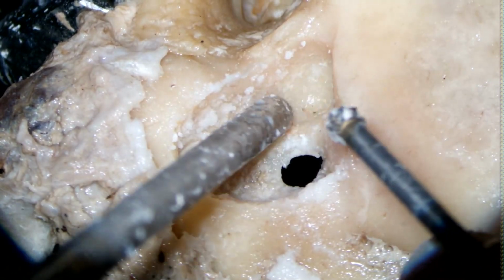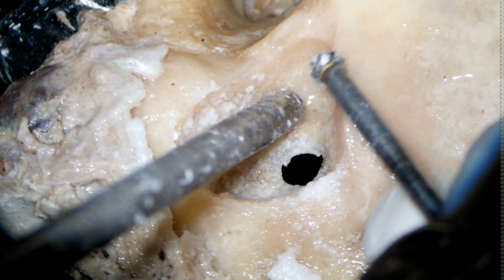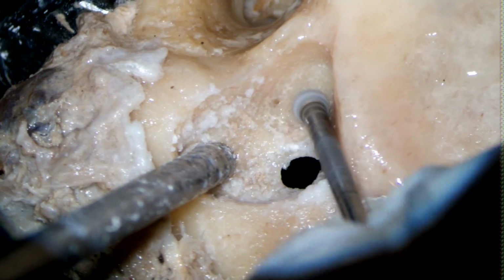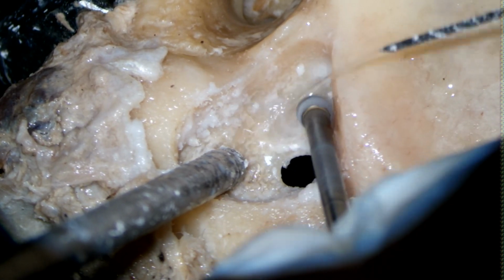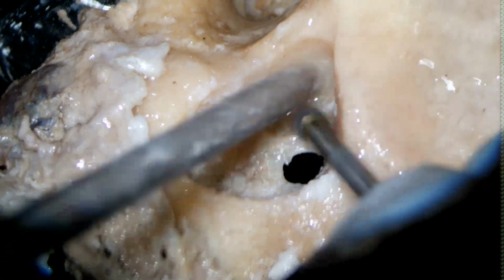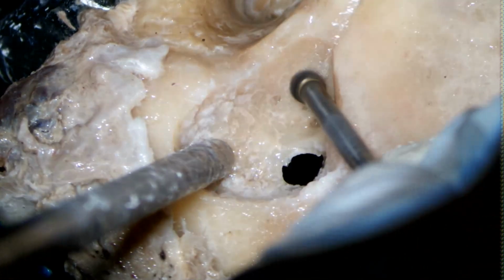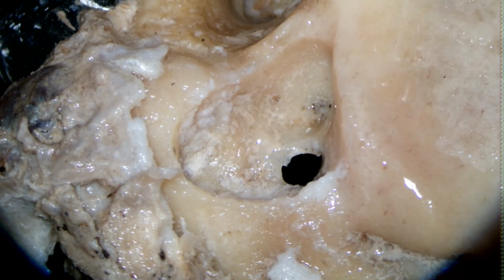So one of the landmarks which you should be able to see when you are into the antrum is the lateral semicircular canal. Okay, I can see now some cells which probably look like, I don't know.